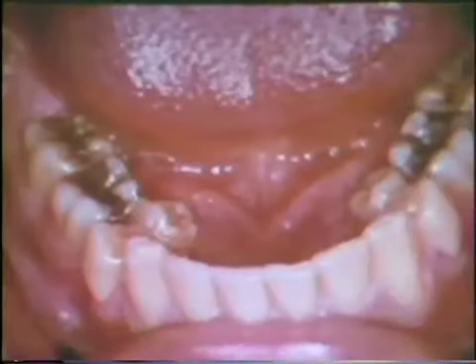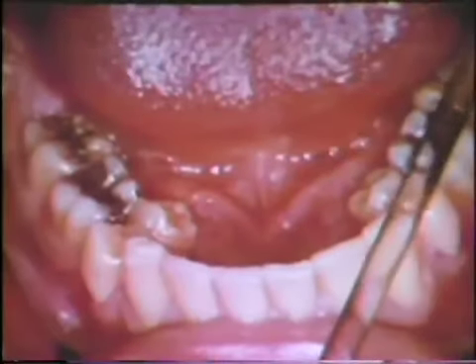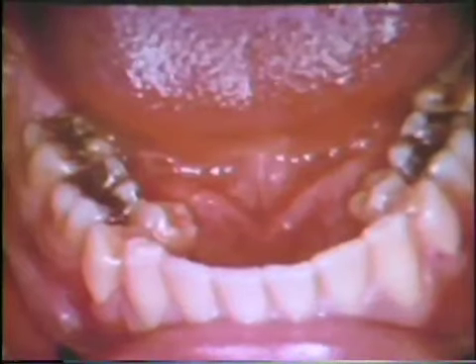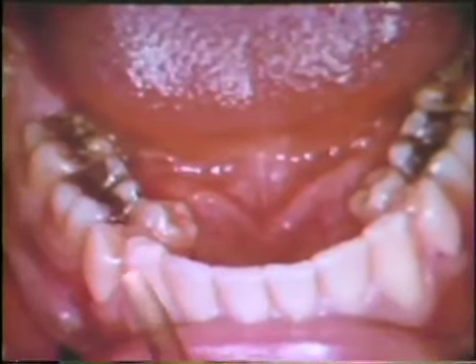In yet another case, we note that the lower second bicuspids are displaced lingually. This situation will require special methods to successfully radiograph the interproximal contact areas. These special methods will be explained in due course. Now, however, we will proceed with our standard procedure.